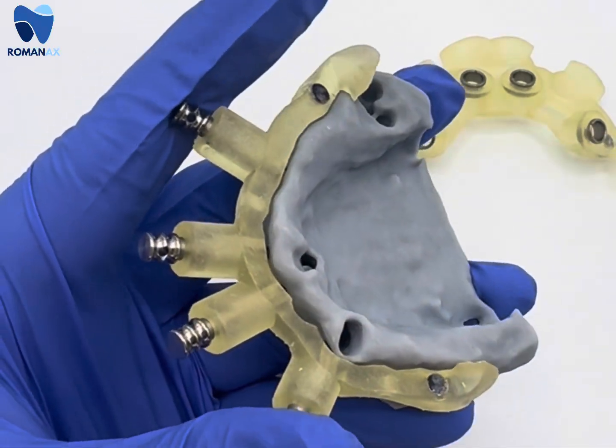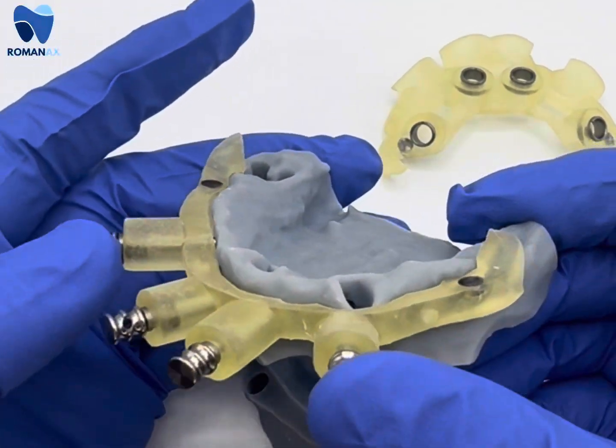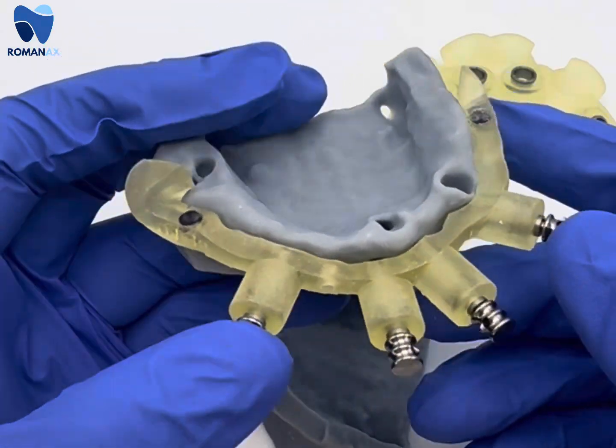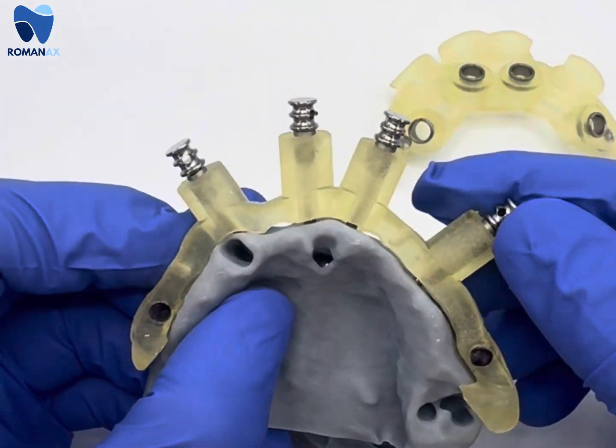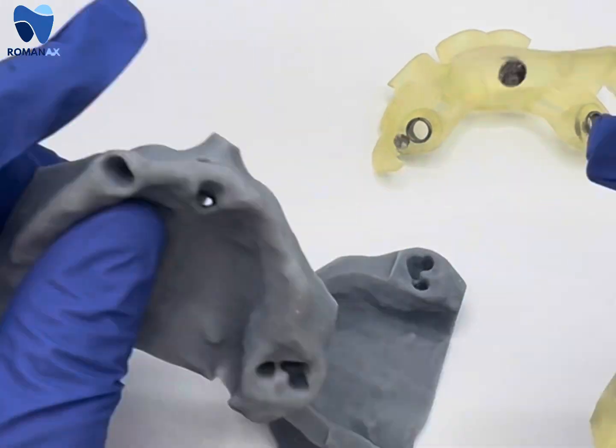Once the pin guide is used, we can go ahead and remove it just by pulling it off, or if you have interlocking pins in place, remove those first. There your bone is exposed to the level that we reduce. You only have to retract on the buccal facial side the tissue.